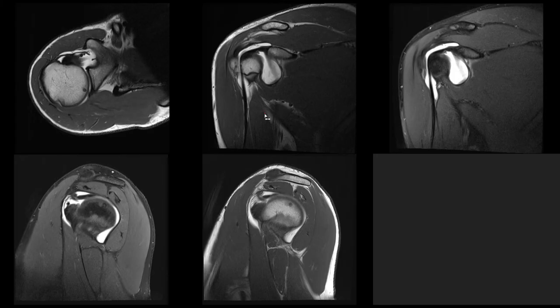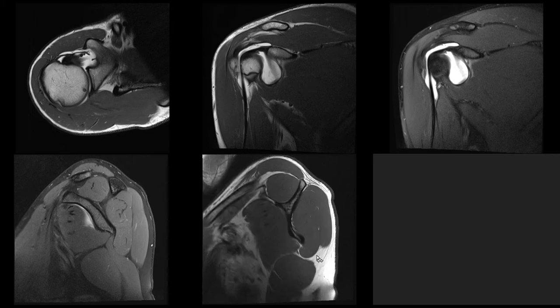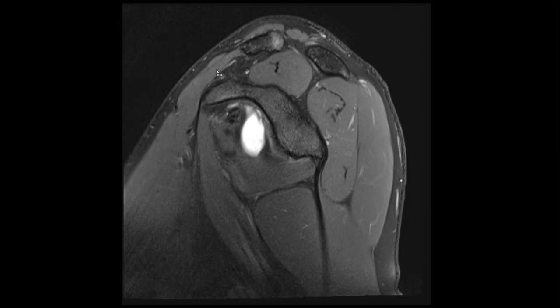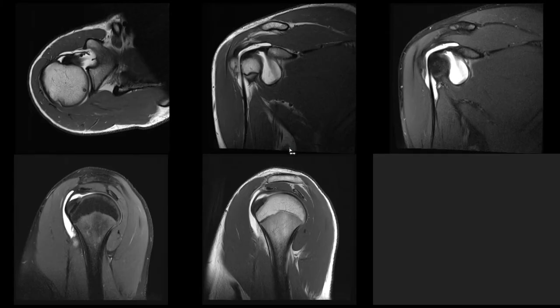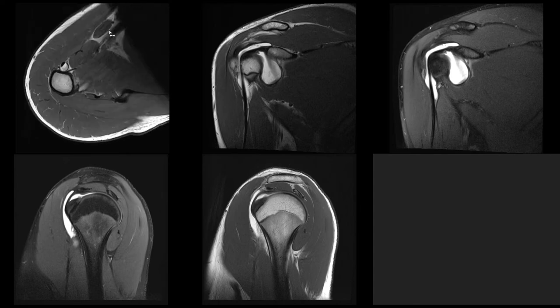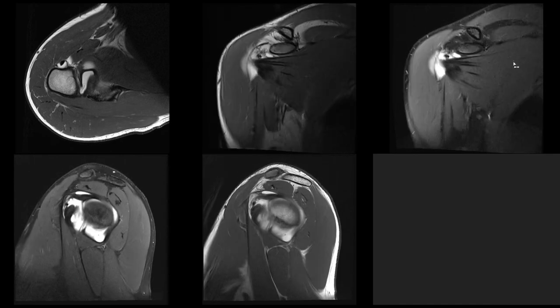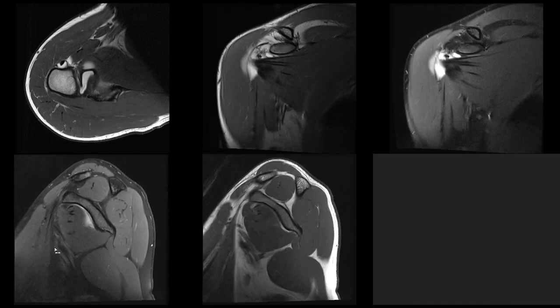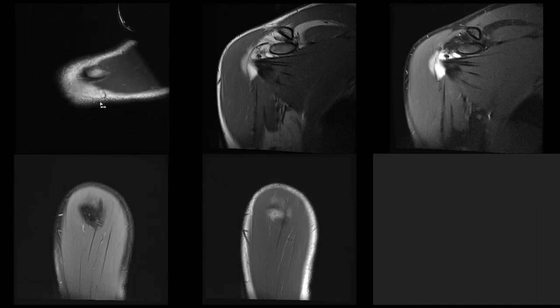The next thing you want to look at are the periarticular soft tissues and the musculature. It's easy to start off with the rotator cuff muscles — you can see they are all nice, no fatty streaks, no atrophy, and on your fluid sensitive sequences there is no edema. Next, make sure that there are no enlarged lymph nodes. Depending on your protocol, sometimes you can really see the axillary structures and lymph nodes, so make sure you don't miss anything there. And while you are at it, also have a look at the lung — you don't want to miss lung cancer or any other abnormalities.